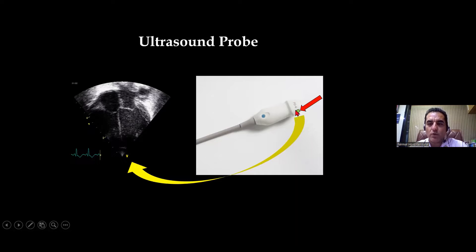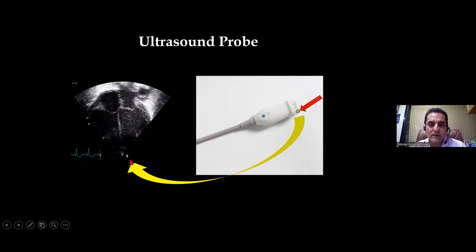The probe marker tells you the sidedness of structures. Suppose I put a probe on the apex of the heart with the probe marker facing toward the left side — this means the chambers on the side of the probe orientation marker are the left atrium and left ventricle, while the other side shows the right atrium and right ventricle. If I rotate the probe so the marker faces the right side, those structures become right atrium, right ventricle, left atrium, and left ventricle. The structures always synchronize with where the probe marker is facing — that is the importance of the probe orientation marker on the screen.